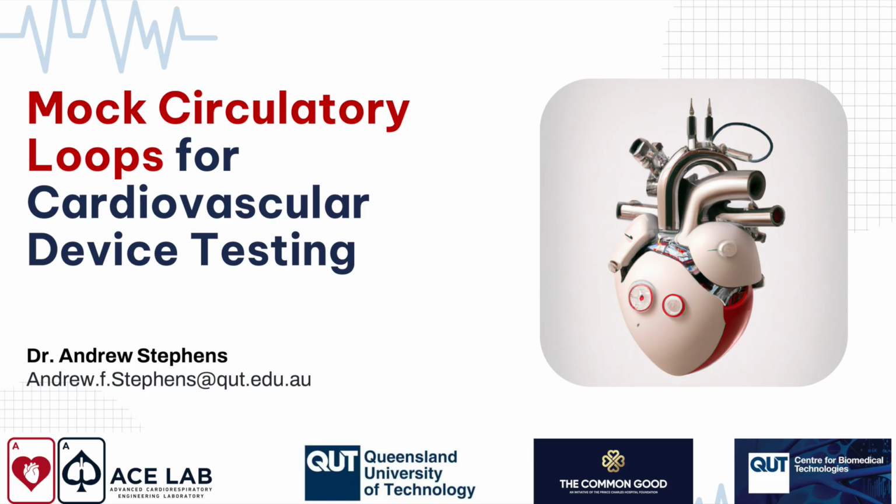And this exists entirely within our ventricles. So your left ventricle and your right ventricle have different Starling mechanisms. The way that we model this in mock loops is we look at volume as an indicator for how hard our heart needs to pump. And we can generate these curves, which you can find in different textbooks, and read, well, if my heart is this full, how much does it need to pump out on the next cardiac cycle? And this is a fixed relationship. So you don't actually even need to use any control system. You just know if it's this full, pump this hard. And then you can find the Starling curve, which represents the kind of patient that you're interested in looking at.